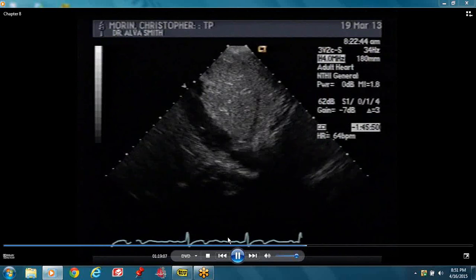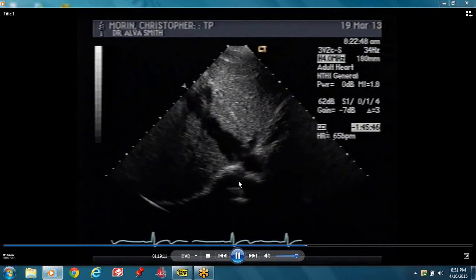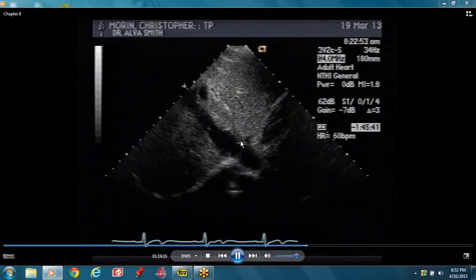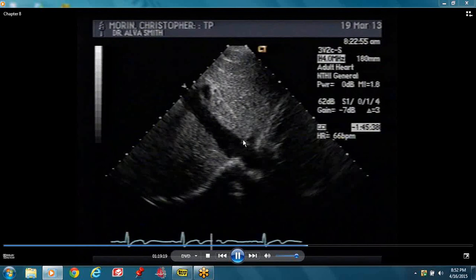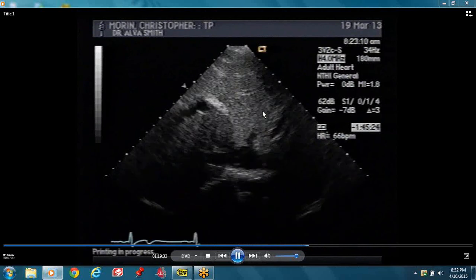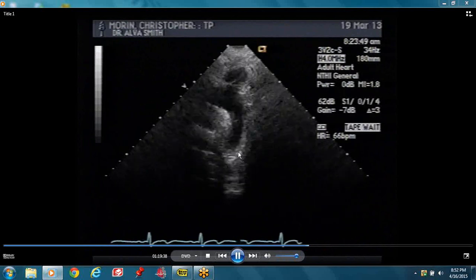Now we're looking at some vessels. This is our inferior vena cava. The hepatic vein comes off the inferior vena cava and goes into the liver. You measure your IVC just proximal to the hepatic vein.